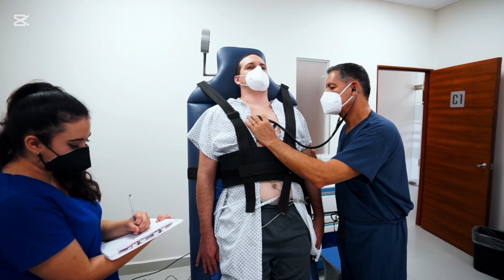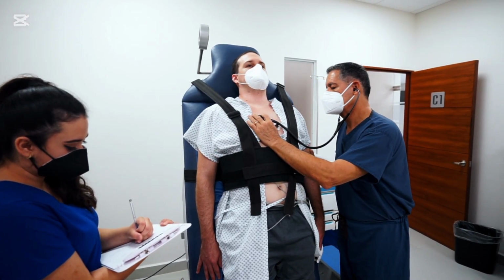Hi everyone, welcome back. In today's video, in this tutorial, I am going to show you how to use the stethoscope to listen to the heart sound.